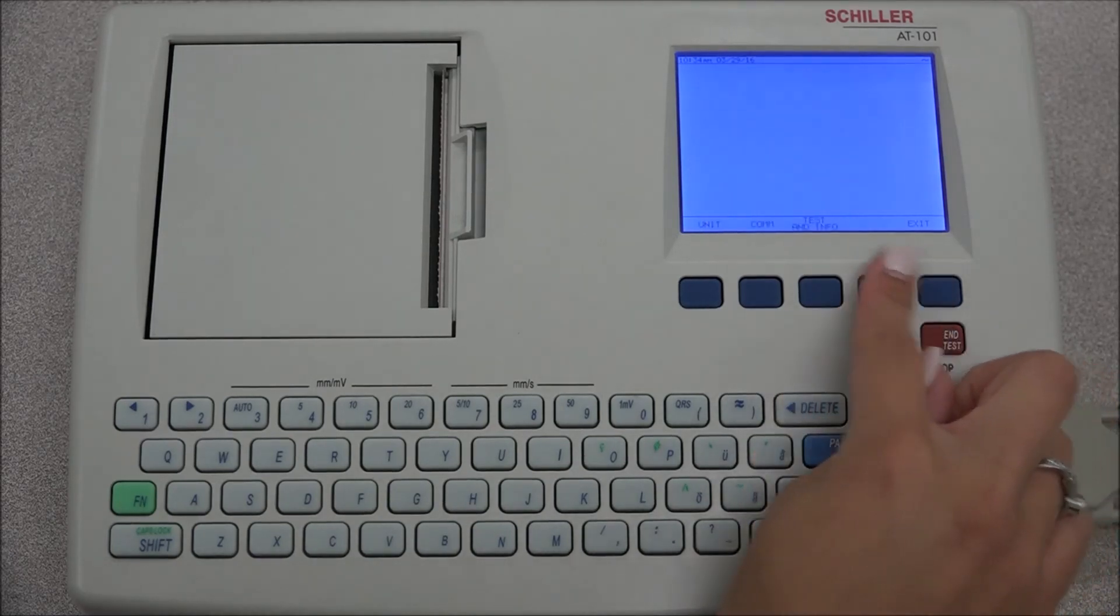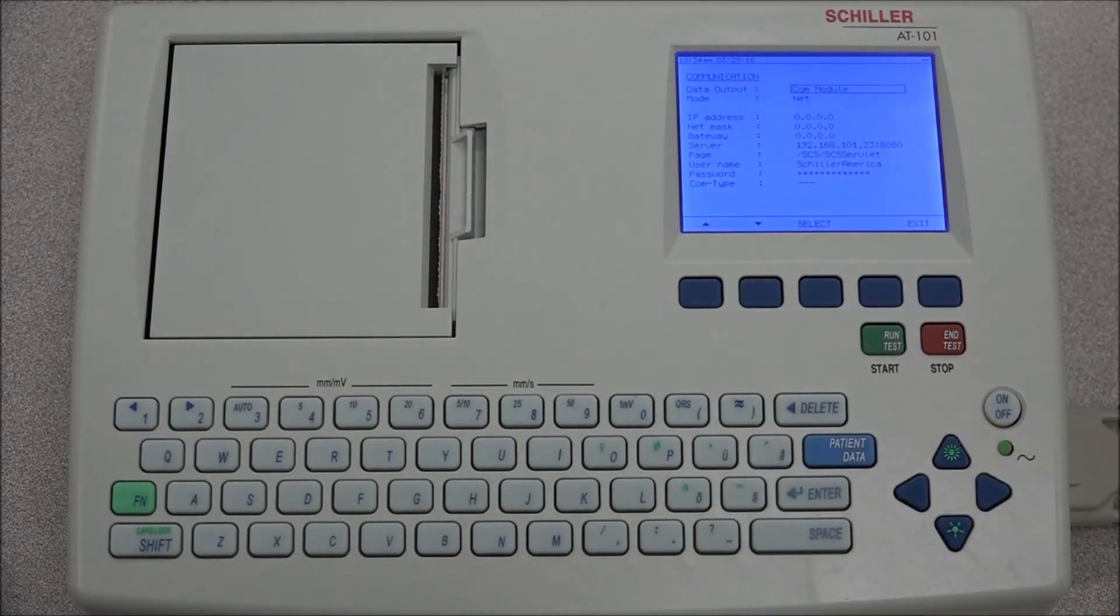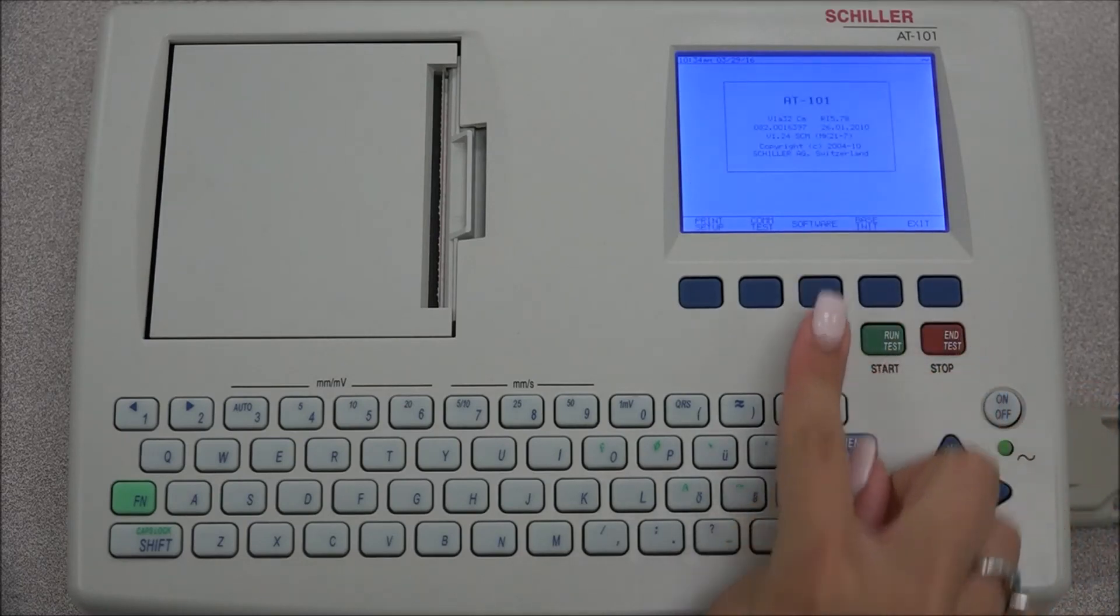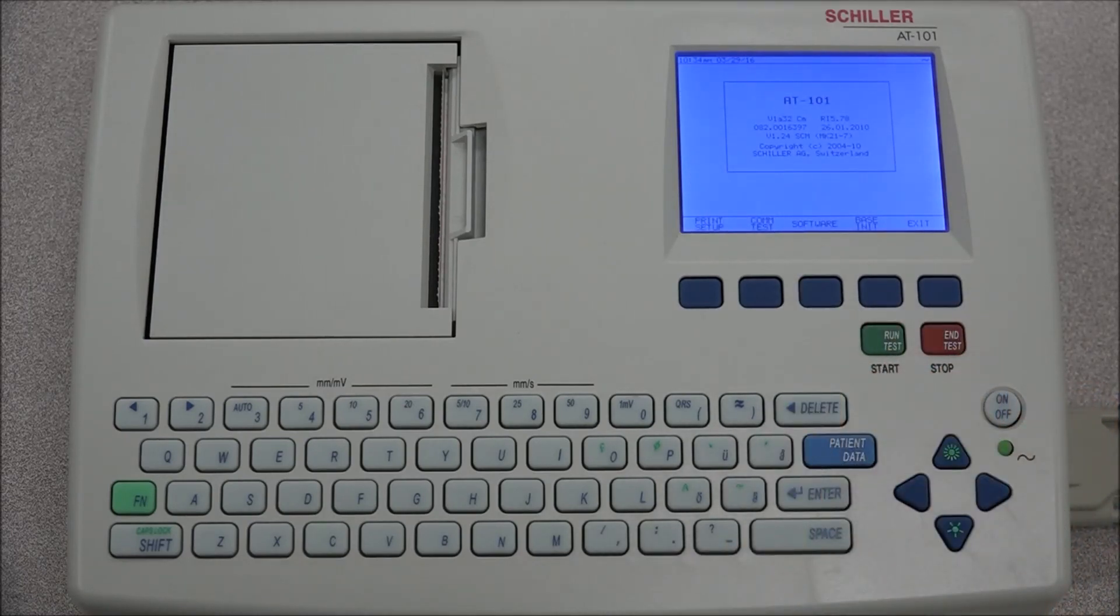Under communications, all settings regarding the communication parameters are set. And under test and information, a code of the options installed is displayed after the software version.